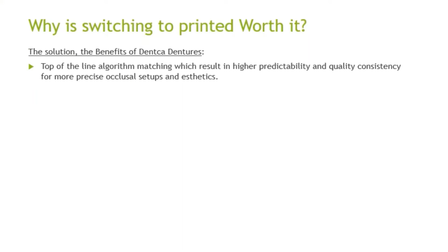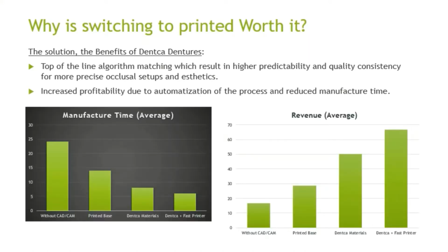So what is the solution? DENTCA created different solutions. First, they created a top-of-the-line matching algorithm that results in higher predictability and quality consistency for more precise occlusal setups and aesthetics with DENTCA Design. Also, there's increased profitability when you automate the process.